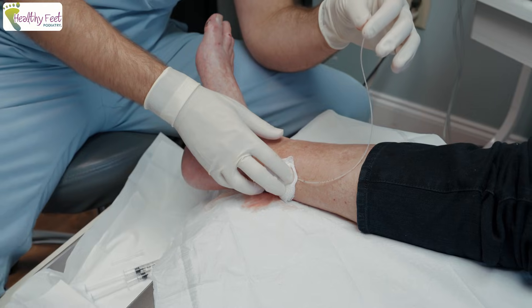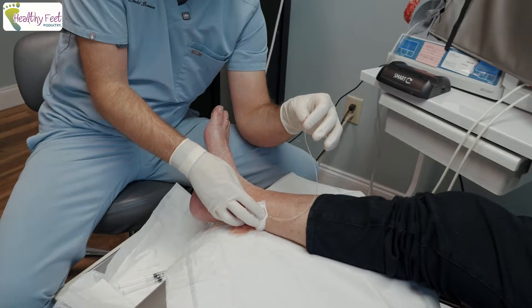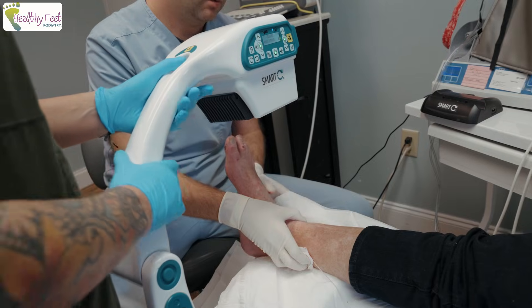I'll do one more X-ray just to make sure we look good, and then we'll just throw a stitch down.